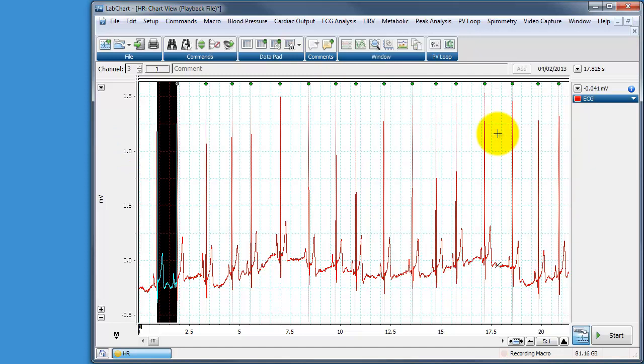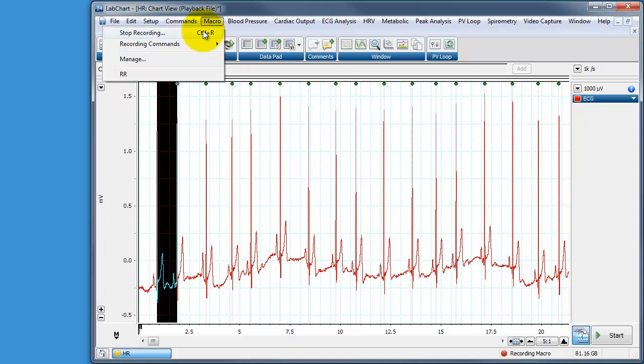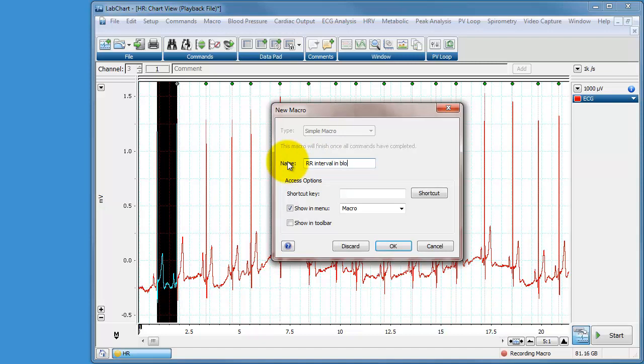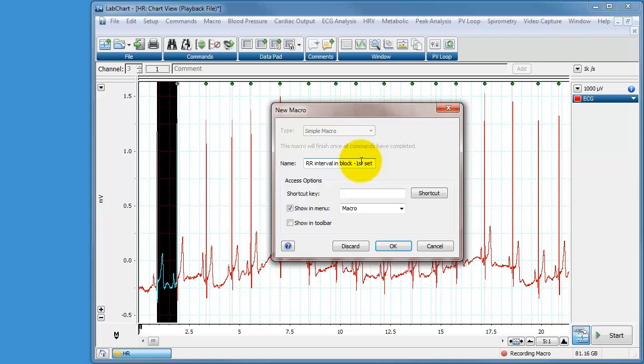And in fact we can now stop recording the macro by going to macro stop recording. It'll ask us what we want to call it, and I'm going to call it rr interval in block. And I'm going to put in brackets, first set. I can't do that, I'll just change that. So the first rr interval is not going to measure it, it's just going to kind of use that as a line of sight to set it up. And I'm going to save that.